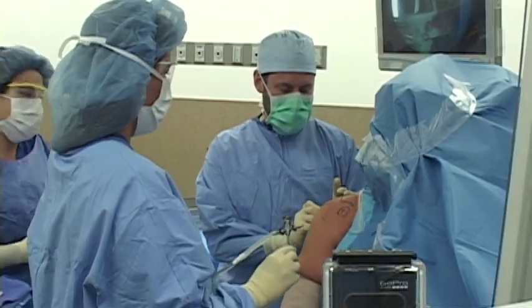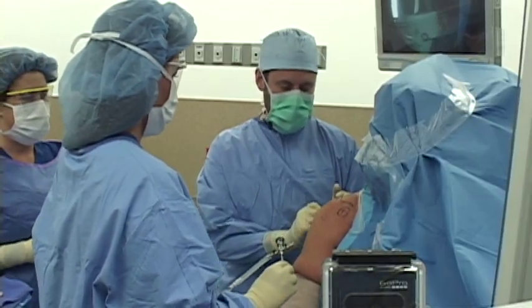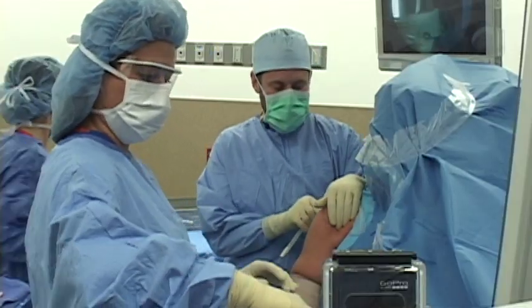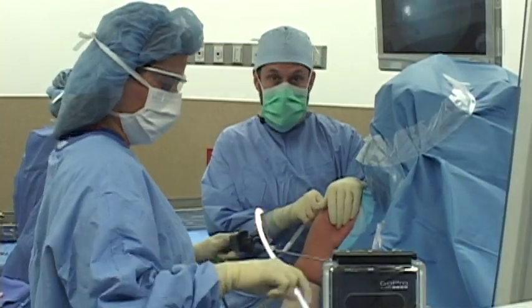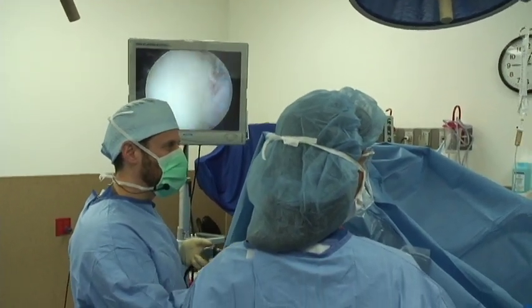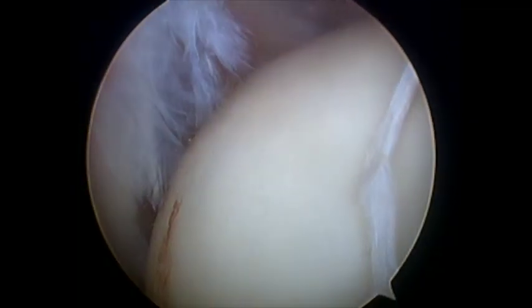The first thing we'll do is make an incision in the back of the shoulder — very small, about a centimeter, a half an inch long — and we'll put a camera into the shoulder joint. We'll fill the shoulder joint with water and take a little bit of a look around. The first thing we see is the socket of the ball and socket joint, and then we'll look over at the ball. So there's the ball and there's the socket.